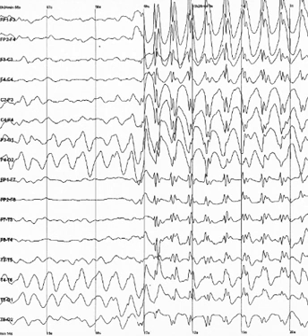In 2018, a functional dry electrode composed of a polydimethylsiloxane elastomer filled with conductive carbon nanofibers was reported. This research was conducted at the U.S. Army Research Laboratory. EEG technology often involves applying a gel to the scalp, which facilitates strong signal-to-noise ratio. This results in more reproducible and reliable experimental results. Since patients dislike having their hair filled with gel, and the lengthy setup requires trained staff on hand, utilizing EEG outside the laboratory setting can be difficult. Additionally, it has been observed that wet electrode sensors' performance reduces after a span of hours. Therefore, research has been directed to developing dry and semi-dry EEG bioelectronic interfaces.